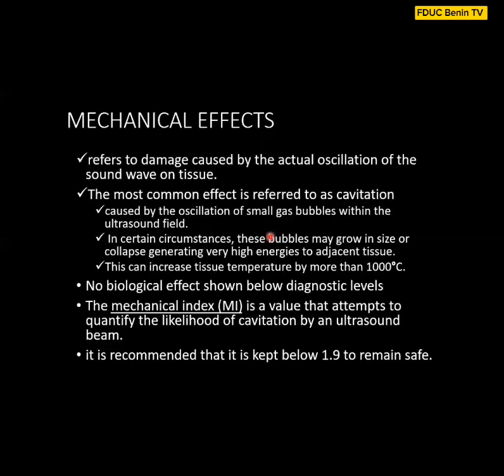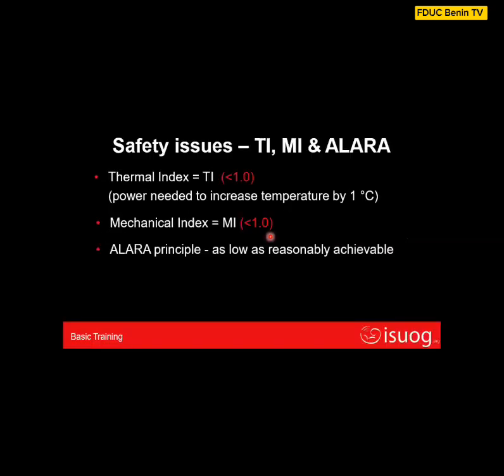The mechanical effect reflects the damage caused by the actual oscillation of sound waves on tissue. This is also caused by too much exposure, when you stay too long on one area while scanning a tissue. They say it can cause some small gas bubbles within the ultrasound field. Some bubbles can be produced when you spend too much time on the spots. The thermal index should be less than 1, and the mechanical index should also be less than 1.